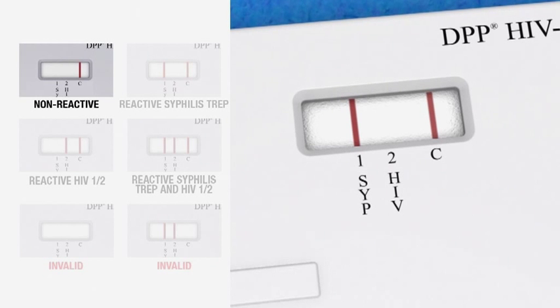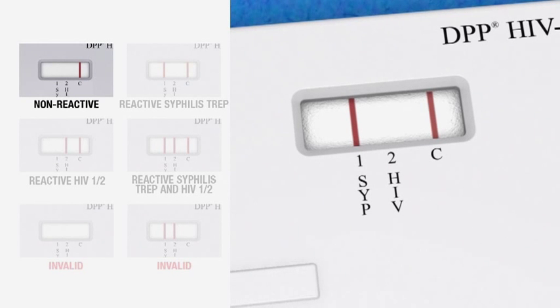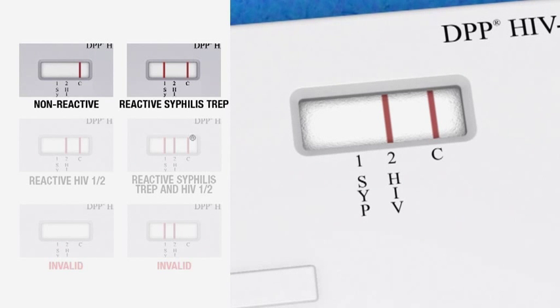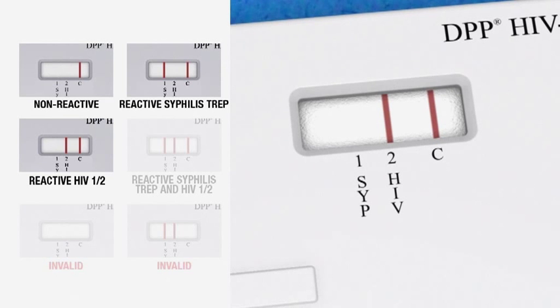If a reddish line is visible above the SYP marking and a line is visible above the C marking in the test window, then the result is reactive for syphilis, meaning that the patient is preliminarily positive for syphilis treponema antibodies. If a reddish line is visible above the HIV marking and a line is visible above the C marking in the test window, then the result is reactive for HIV, meaning that the patient is preliminarily positive for HIV-1 and/or HIV-2 antibodies.